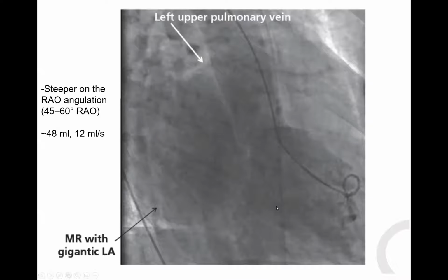One, you can perforate the ventricle. Two, you create a fake MR because you're injecting all your volume in the chordae. So you should never do that, and you're not going to get a good LV-gram. So you may have to make sure your catheter is free, and it's normally in the middle of the LV cavity. Okay, so those are general hints.